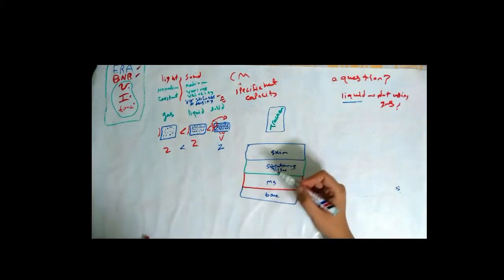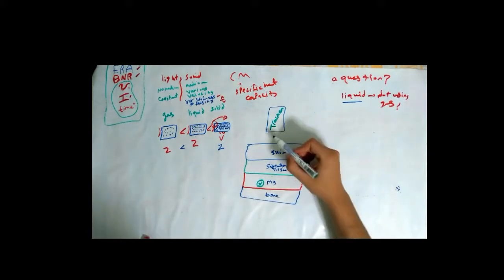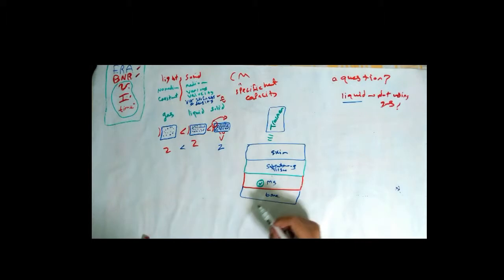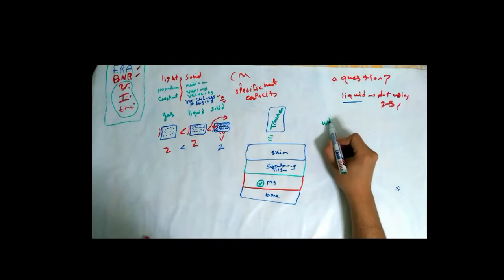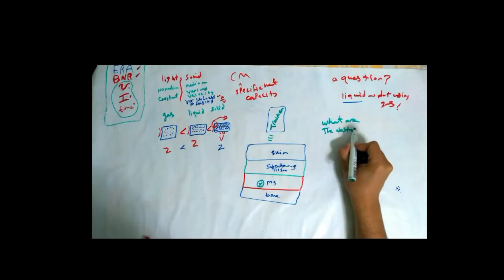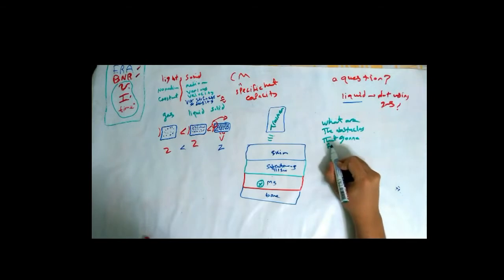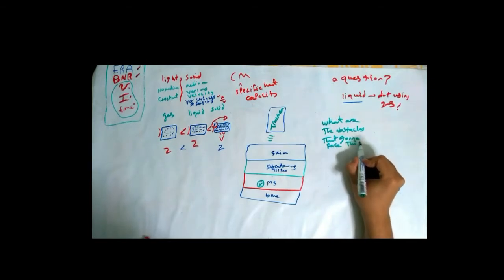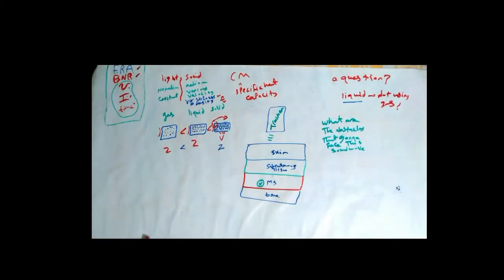Now if I'm treating a lesion at the muscle here, the sound wave must propagate through all three different mediums to reach the muscle. So what are the obstacles that are going to face this sound wave, and how to treat them?